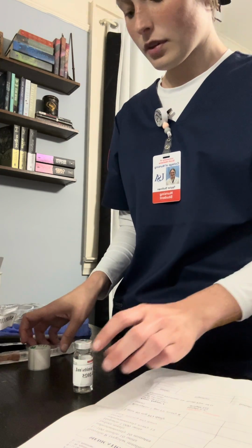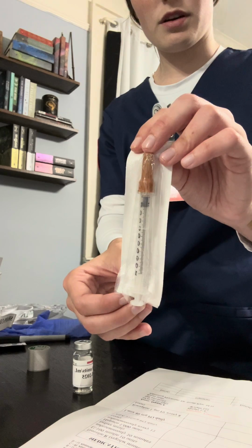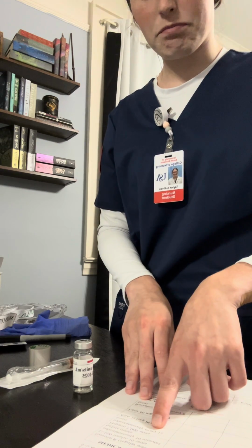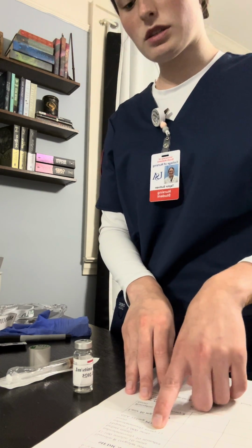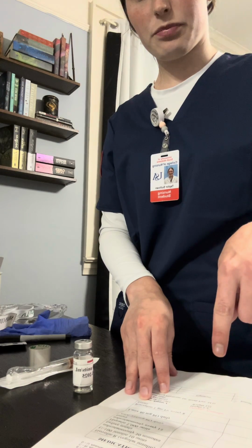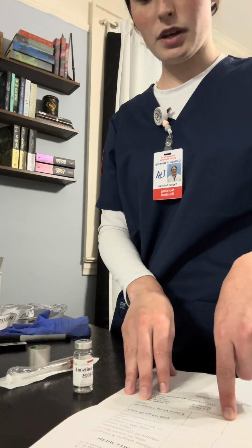So I have a tuberculin syringe for my route. It's got the needle already in there. Time is every 12 hours. Mr. Jones has not had his heparin yet, so he is in time to get this injection.